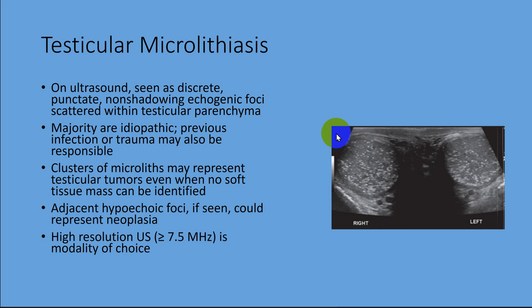As we see here in this ultrasound, the transverse view for both testes — this is the right and this is the left — we see small hyperechoic areas about 1 to 3 mm in both testes, more to the right side in this patient. There is no significant shadowing, so these are ecogenic foci scattered within the testicular parenchyma without shadowing.